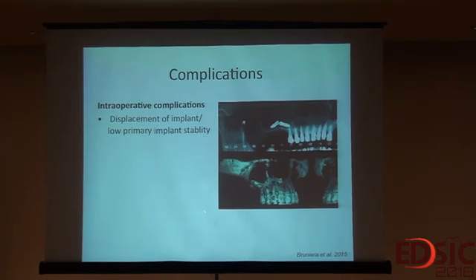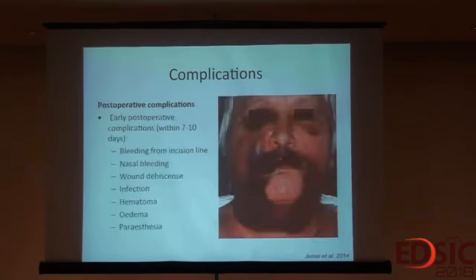Another complication is displacement of the implant due to low primary stability. Here you see the implants in the sinus cavity due to low primary implant stability. A preoperative CBCT is recommended to evaluate the need for a two-stage or one-stage sinus elevation to reduce the risk of implant displacement. A displaced implant should be removed to avoid chronic sinus problems.